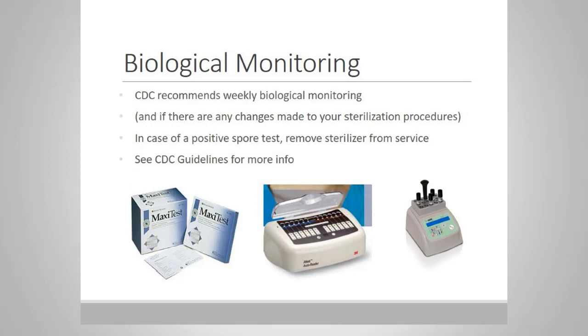Biological monitoring. The CDC recommends weekly biological monitoring, but be careful. Those of my colleagues who are listening, and especially in Canada, know that you have different recommendations based on your provincial guidelines, and different countries may have different regulations with regard to monitoring as well. So know that the CDC recommends weekly, but know that your regulatory agencies may have other guidelines for you as well.